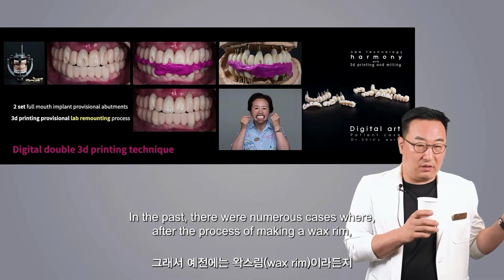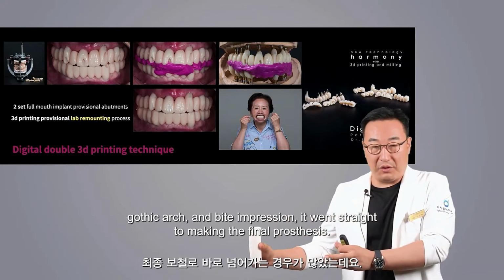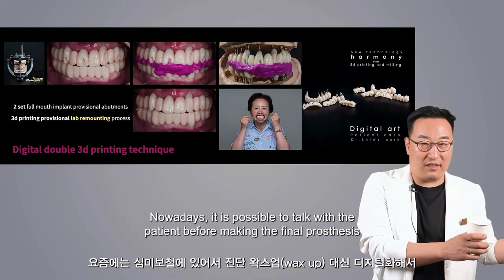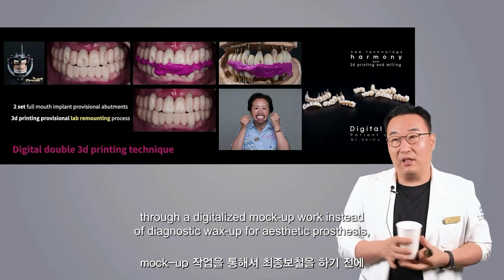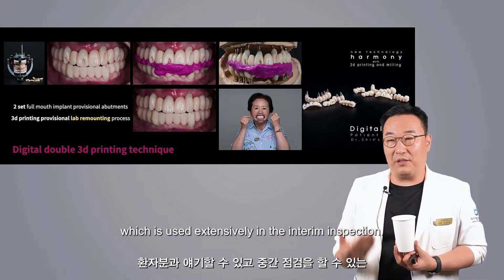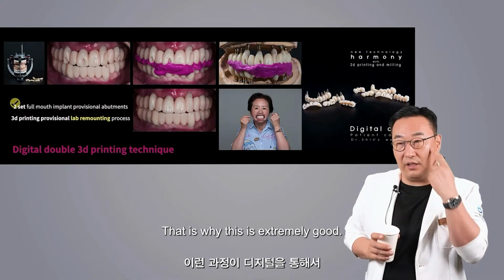In the past, there were numerous cases where, after the process of making a wax rim, Gothic arch, and bite impression, it went straight to making the final prosthesis. Nowadays, it is possible to talk with the patient before making the final prosthesis through a digitalized mock-up work instead of diagnostic wax-up for aesthetic prosthesis, which is used extensively in the interim inspection. That is why this is extremely good.